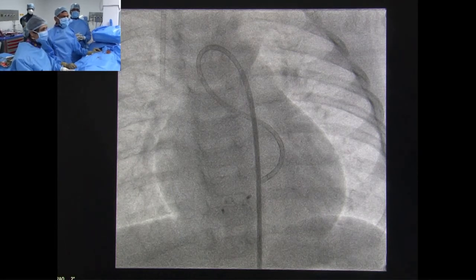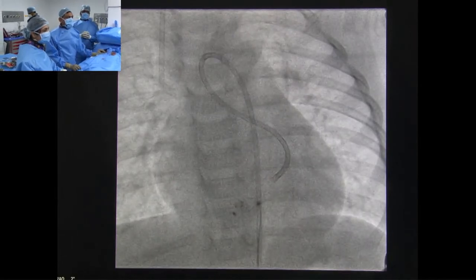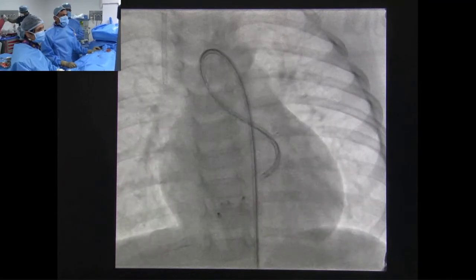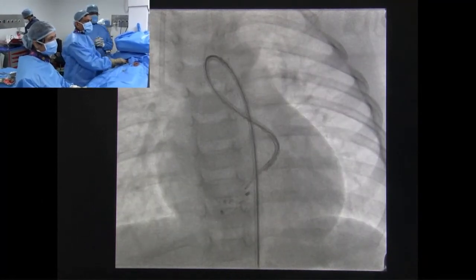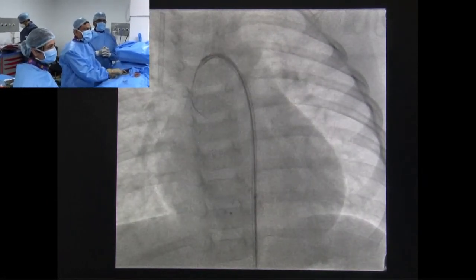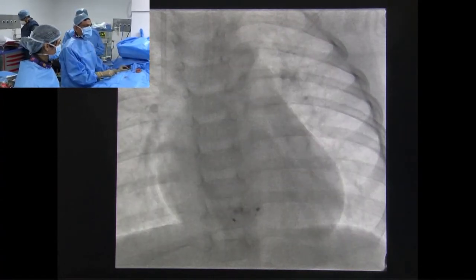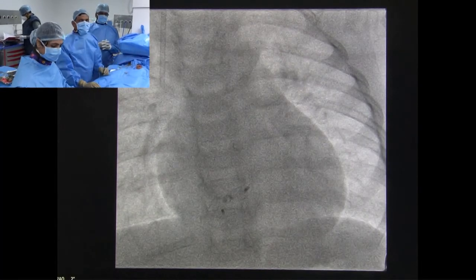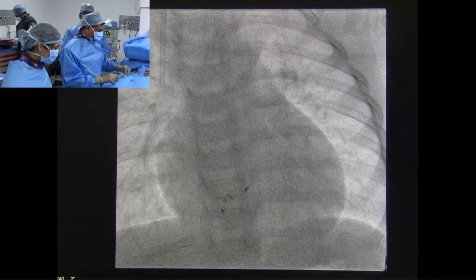What is going to be your antiplatelet or anticoagulant regimen in this patient? This patient, I think because it's a distal fistula and a lot of aneurysmal segment of circumflex, I would prefer to give warfarin for 6 months. After that, we will give lifelong antiplatelet medication. You may ask one, sir? My other question, Nageshwar, is that since the device is not well formed and it is kind of got elongated, what are the chances that the residual shunt might persist?